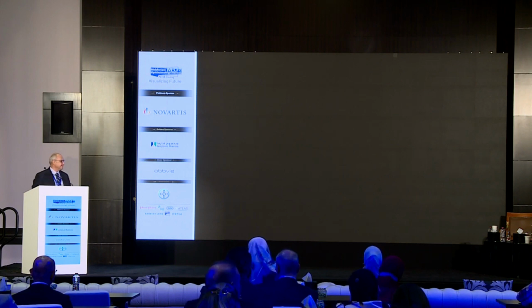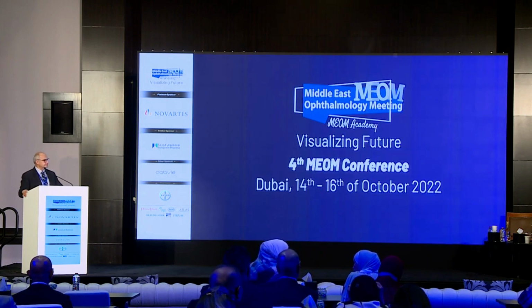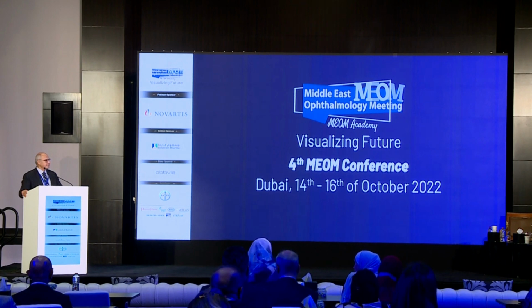Dr. Yahya, it's not easy to flip an ICL inside the eye. He's an expert surgeon, so it's not easy because you should protect the cornea and protect the lens. And you are working bimanually in a very closed airspace. You can see whether the ICL is flipped or not from the reflection. This is why the reflection of the optic, when you showed the first picture, is circular, which means that the ICL is flipped down. But it's not that easy if you don't think of the option.